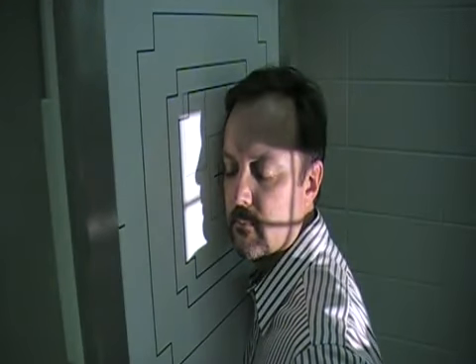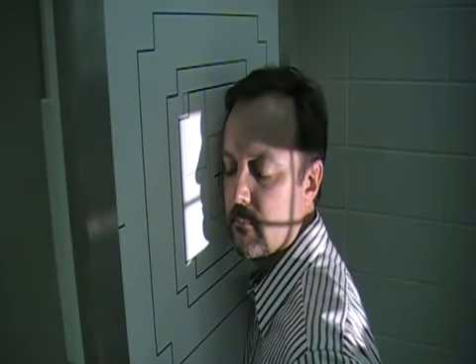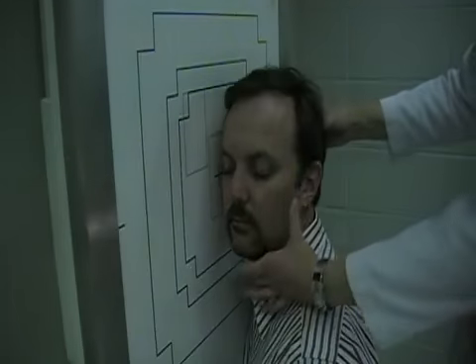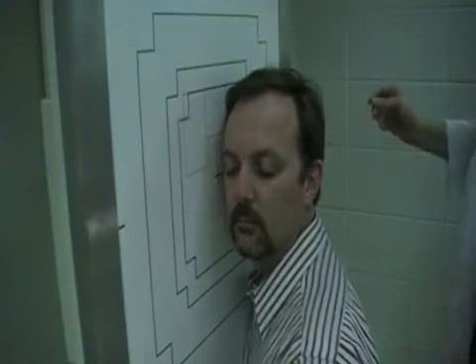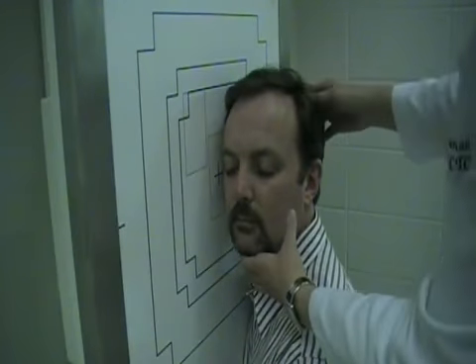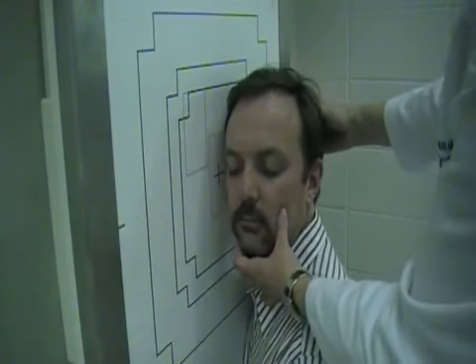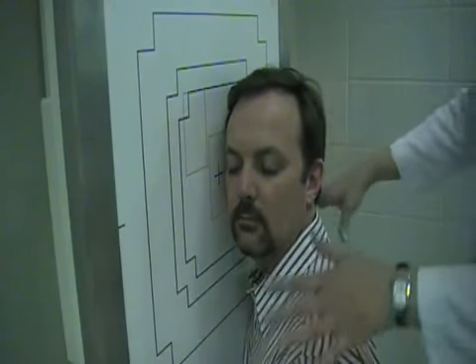Now this does use the same angle as our previous angle. I'm using a 25-degree angle, and have the head lateral. We are imaging for the rami. So double check your interpupillary line, double check your mid-sagittal line, that it is horizontal.